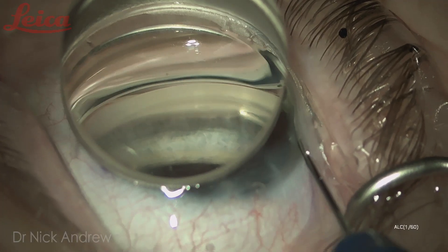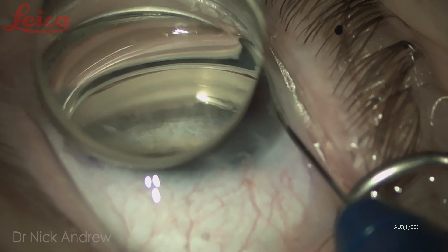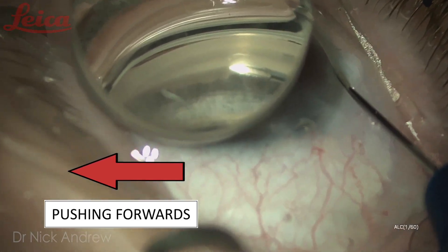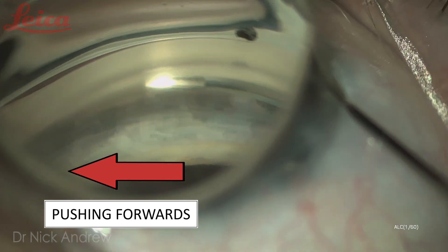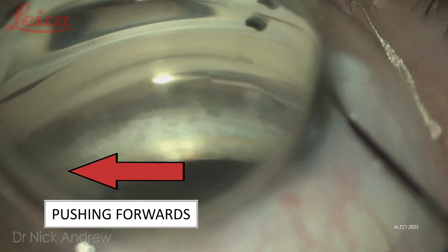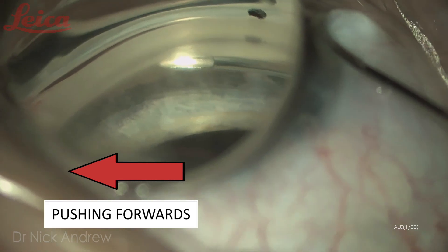Here's what I mean by relaxing your hand. I've just pierced the trabecular meshwork as far to my right as I comfortably can, and now I'm pushing forwards, trying to embed the distal one-third of that hydrus injector tip into Schlemm's canal. I'm wiggling the tip up and down, making sure the hydrus injector is well seated in Schlemm's canal.